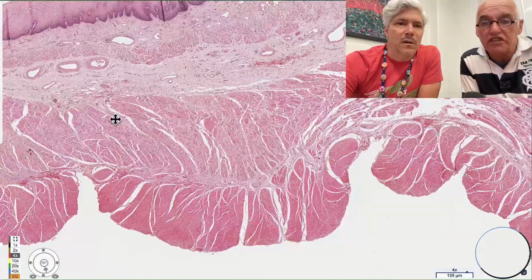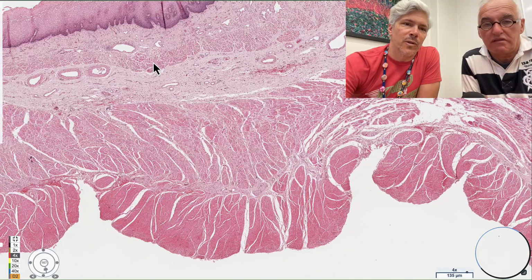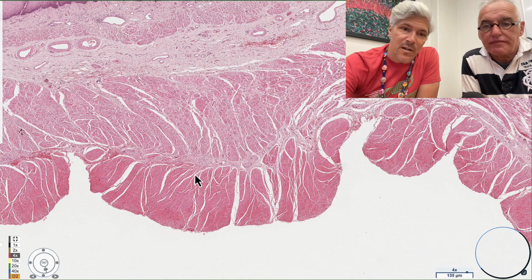Let's move on to the muscularis externa. And then look at this. I just want to note that we have this breadth of muscularis mucosa up here, a smaller strip of smooth muscle as we identified it. And then down here, look at this. I mean, that's a pretty huge chunk. Monstrous layer of muscle. But two layers of color. All right. So this constitutes the entire muscularis propria.